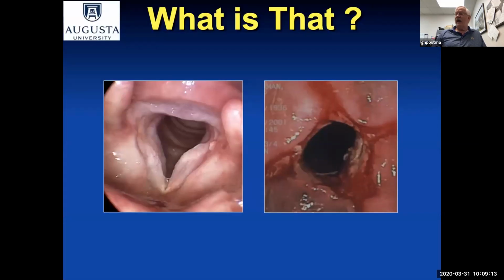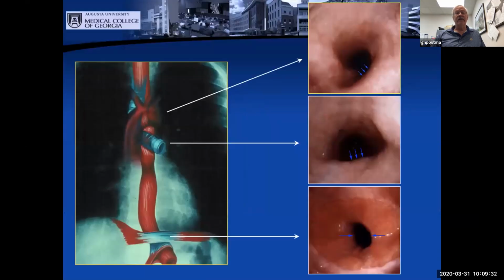So what do we look at? Once again, let's just go through a few things that are fun about the esophagus. Once again, if you can figure out the larynx or be taught and feel comfortable, you can do anything in the esophagus. Patient on the right has rip-roaring grade D esophagitis. So when you do this, and remember the orientation, the bottom of the screen is anterior because you're facing a patient sitting upright in the exam chair.